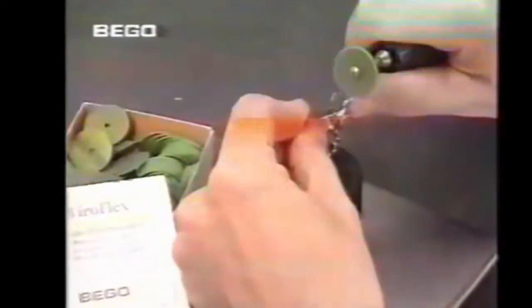Outside surfaces of clasps and rests are rubber polished with a green soft rubber polishing point. Separated or relatively inaccessible areas are rounded with a knife-edge wheel or small wheel.